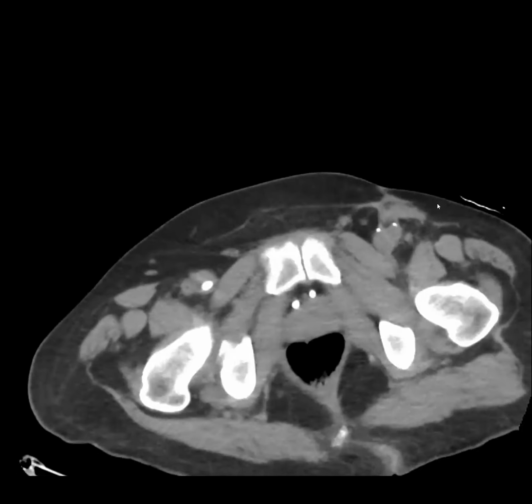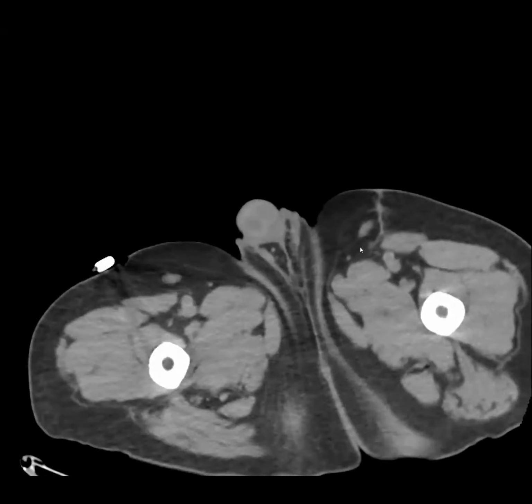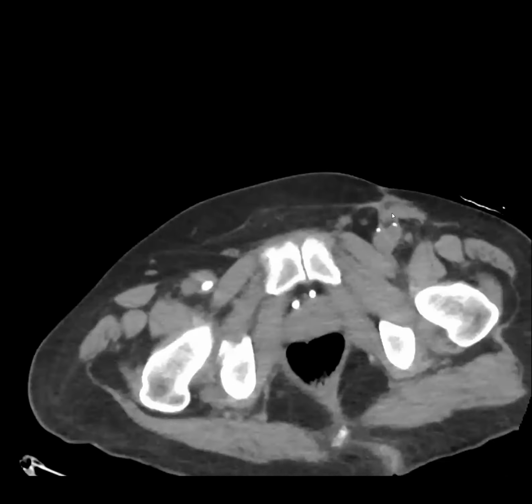So up here, there's asymmetry. It's like they have a flap, or... And down here, they look symmetric. So what is this? Was that on purpose? Yes. So this is a Gracilis flap.